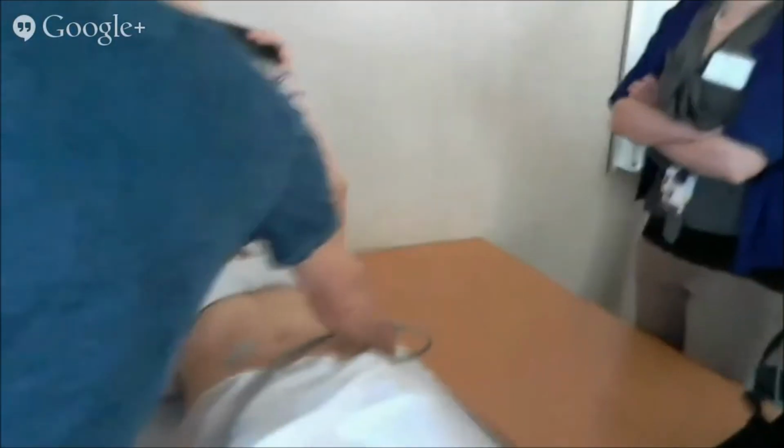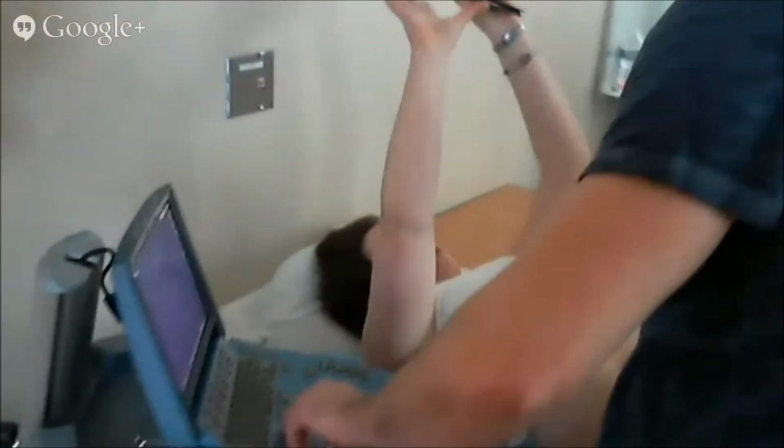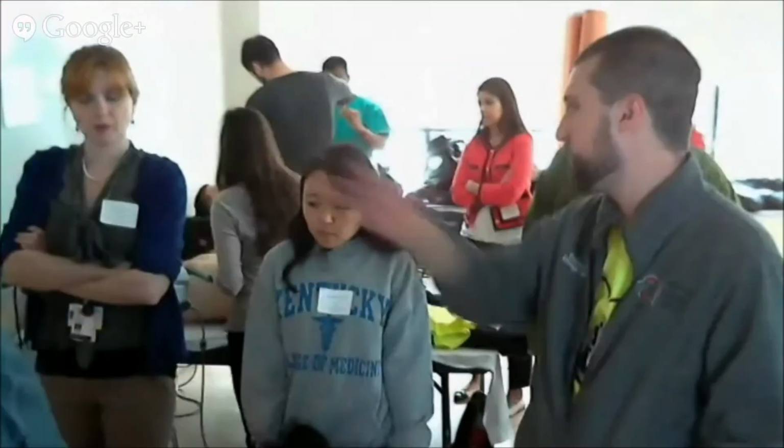The sensitivity of FAST is kind of debatable. People talk about it being more sensitive in the original papers than subsequent studies have shown. But if you do a repeat FAST scan, it actually increases the sensitivity quite a bit. They were doing them about 4 hours on average from the first one. Any patient that becomes unstable or has a change in their acuity and vital signs, that can tell you a lot of information.